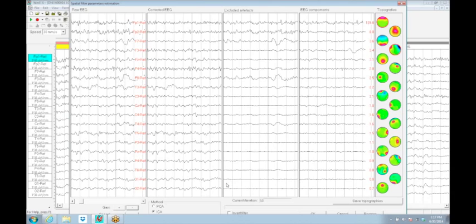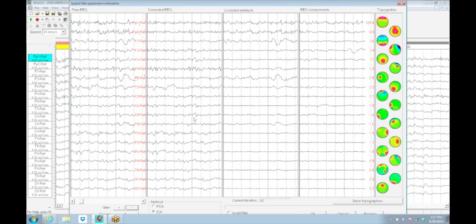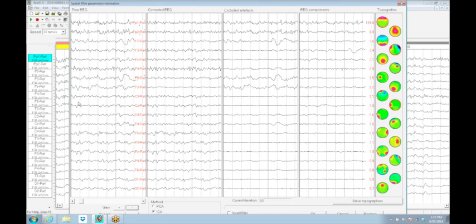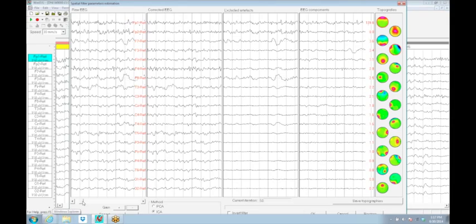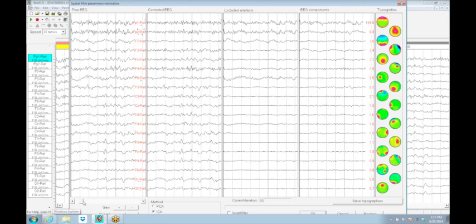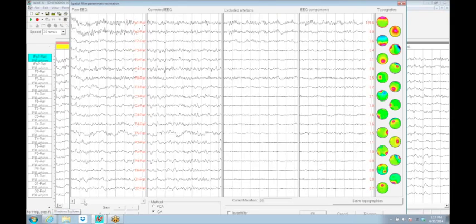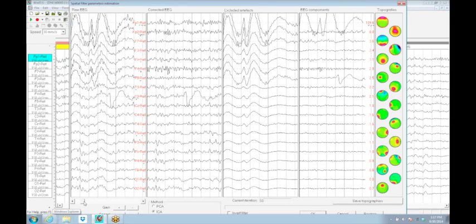Still, in all of this, we still have this left temporal irregularity. If we pull it out using this, it goes as flat as a pancake. We're pulling out discrete component stuff, but we're also pulling out localized T3 activity that's local, only T3. This is not the best way to clean up everything.